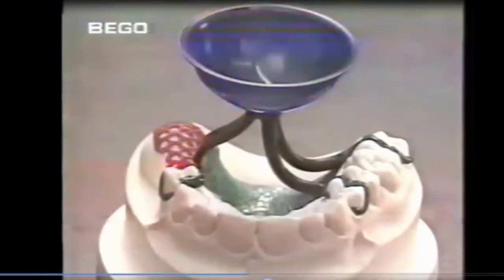The shallow casting funnel former minimizes the height of the mold. Two sprues are generally sufficient in the lower arch. Additional sprues are only required for backings or other thick parts. For this wax-up, by contrast with centrifugal casting, vacuum pressure casting only requires 2 by 4.5 mm casting strips.